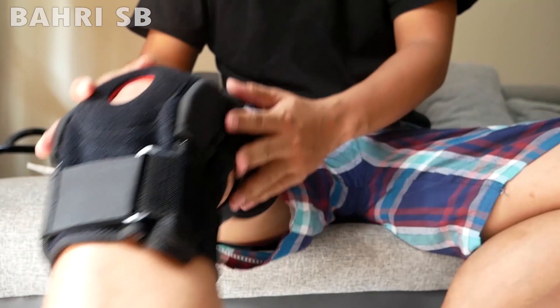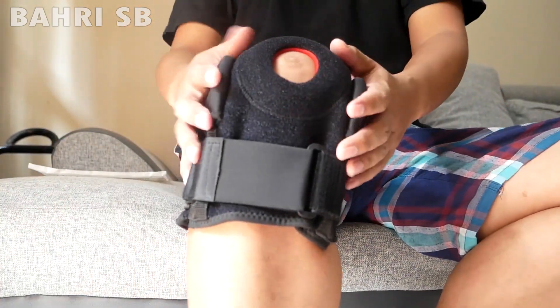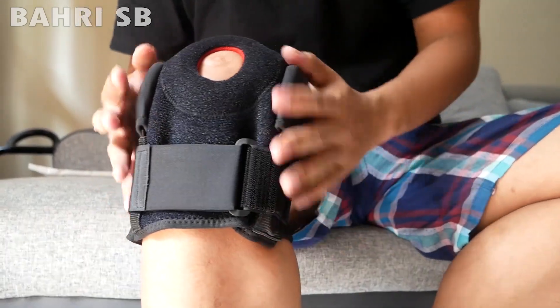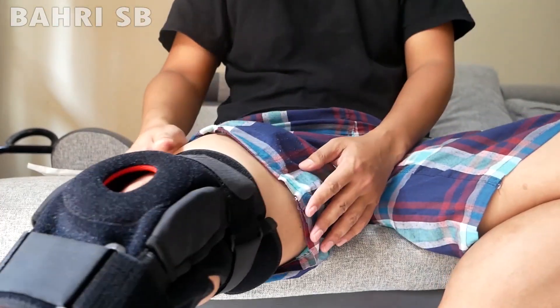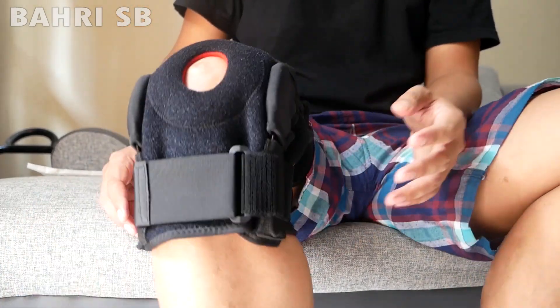Pemasangannya sangat mudah sekali, dan ini juga sangat kokoh, jadi berasa setelah dipakai itu kencang sekali. Jadi ini bisa dipakai saat olahraga ataupun sedang bersantai untuk pemulihan dari cedera.